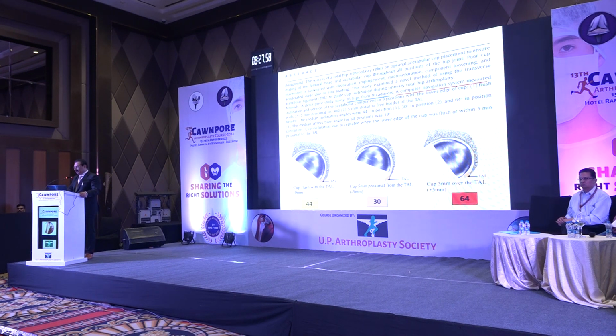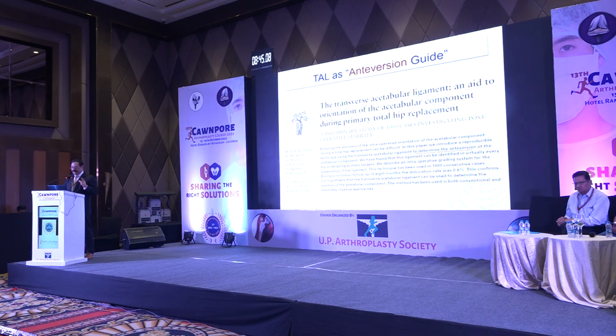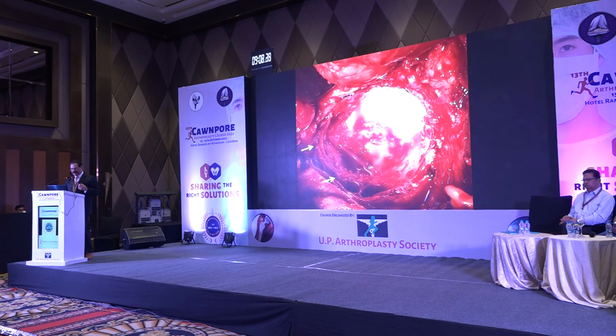The transverse acetabular ligament is not only a good guide for inclination, it is a good guide for anteversion too, again if the acetabulum is non-dysplastic and non-traumatic. And the majority of cases we do are non-traumatic, non-dysplastic. So please use the transverse acetabular ligament as an anteversion guide too. This is a study based on 1,000 cases published in JBJS. Whenever we start doing an acetabulum, we clearly see the margin, the floor, and the transverse ligament before we start reaming. So use the TAL as a good guide for inclination as well as anteversion.